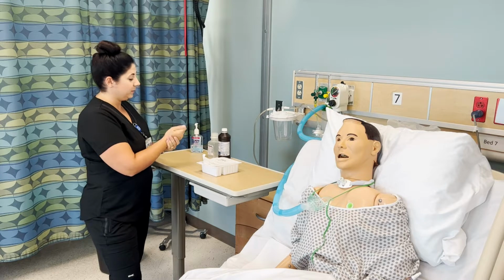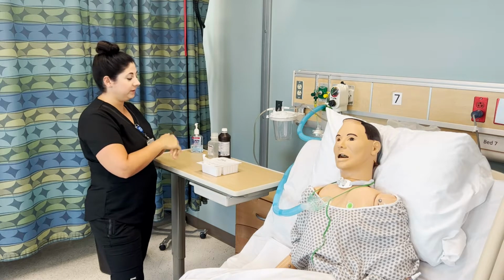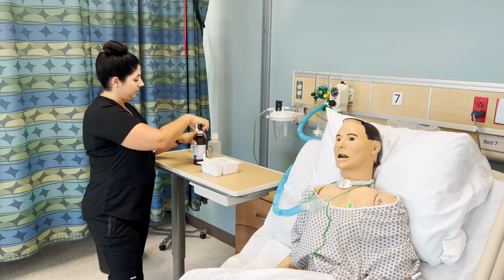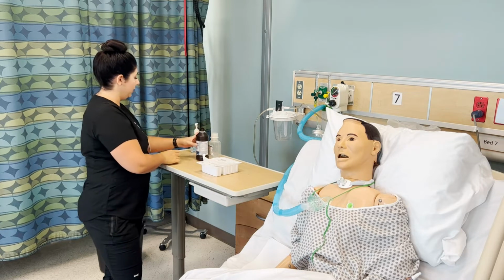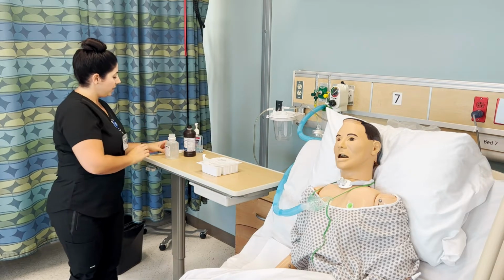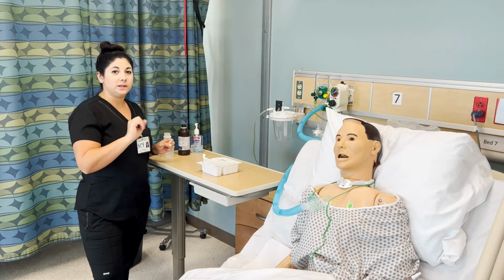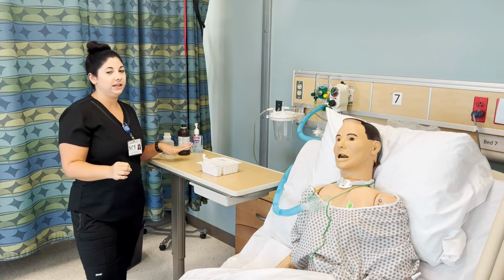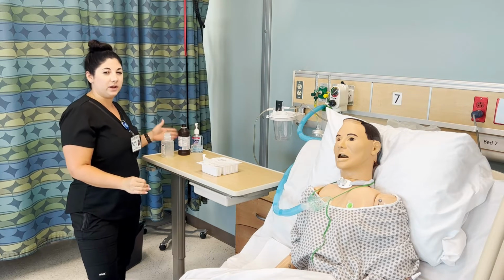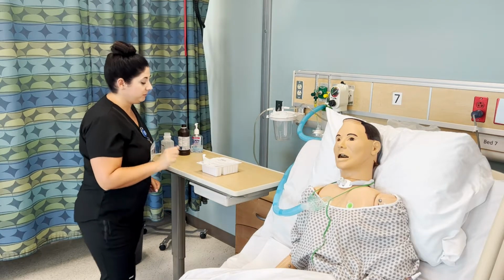And we'll check our bottles, make sure that the expirations are within date. If they are opened, they should be labeled with the time and the date that they were open and initials. I'm going to open each one of them and put the caps next to them. I put my bottles on the far left of the table because I'm right-handed. So I will be using my right hand to remain sterile and my left hand will become not sterile. So when I am transferring my fluid into my container, I want it on my left side. Obviously, if you are left-handed, you'll be doing this on the other side of the bed.